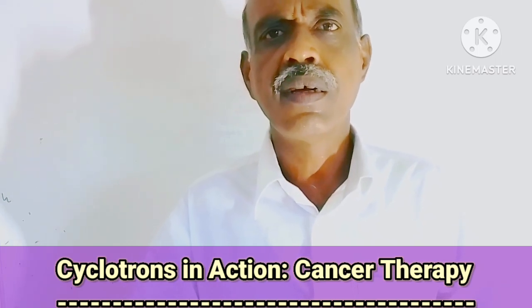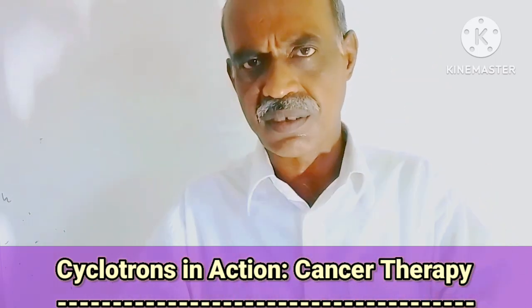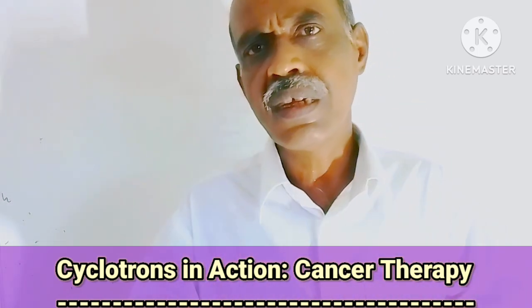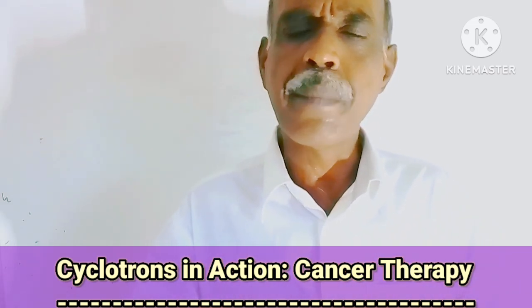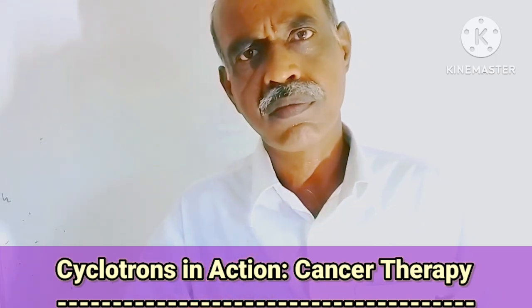Otherwise, by producing reactive oxygen species, ROS, the DNA of cancer cells can be damaged. This is the indirect way. Anyway, the main point was only the Bragg peak and precise control.